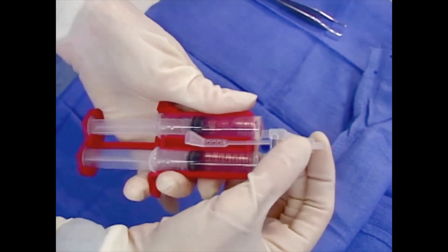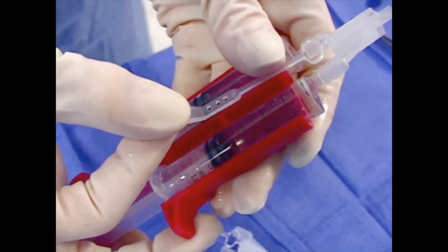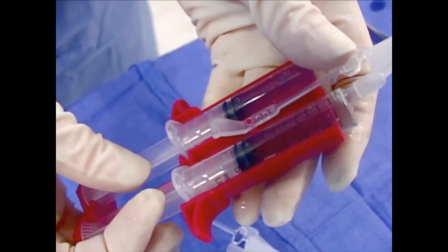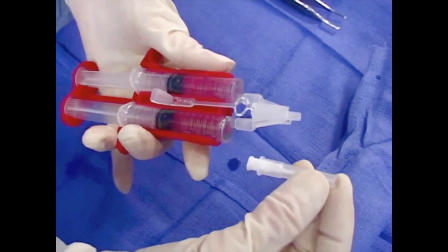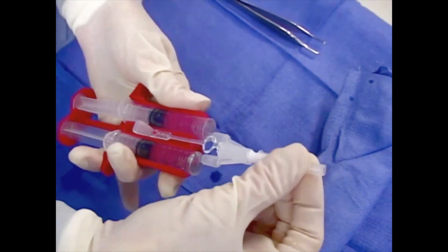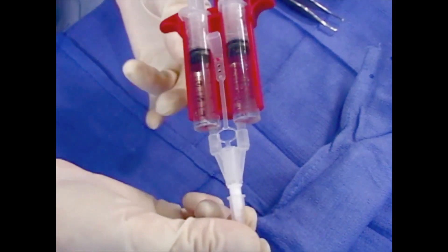Now attach the joining piece to the syringe hubs, ensuring both are firmly seated, and secure the joining piece by fastening the tether strap to the Duploject applicator. Be sure not to push the plunger during handling. Finally, fit the cannula tip to the joining piece. If air is expelled from the cannula tip before use, this could activate the product and create a clot at the tip of the cannula.